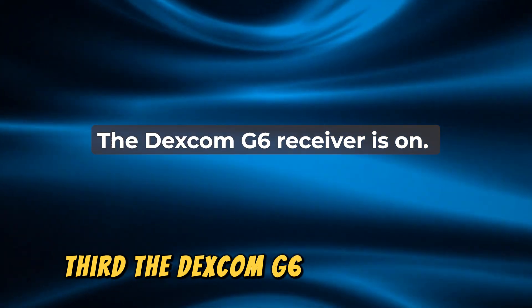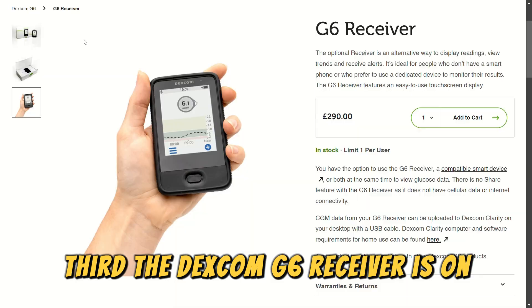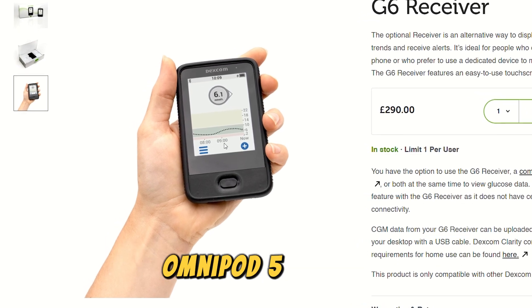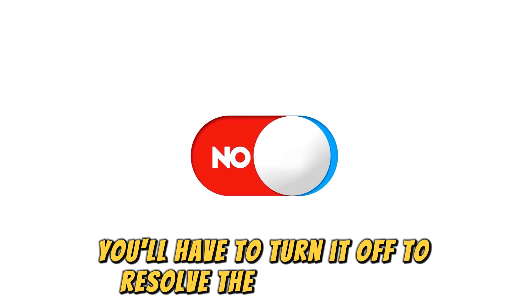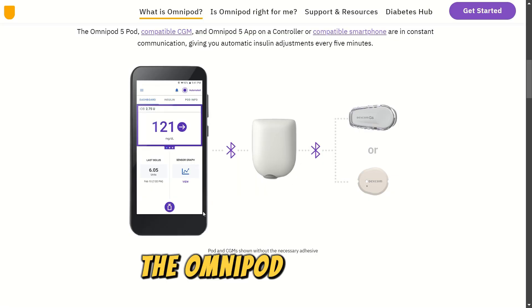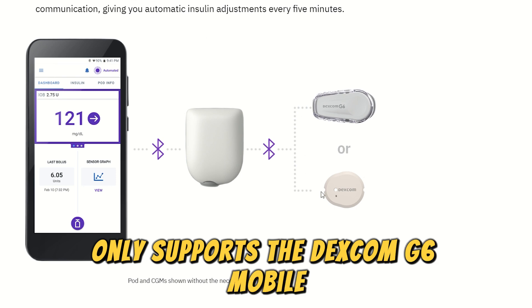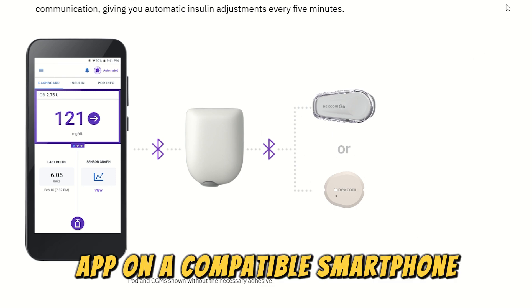Third, the Dexcom G6 receiver is on. Since this receiver can't be used as part of the Omnipod 5 system, you'll have to turn it off to resolve the pairing issue. The Omnipod 5 system only supports the Dexcom G6 mobile app on a compatible smartphone.